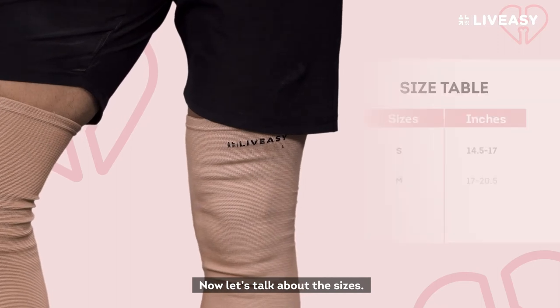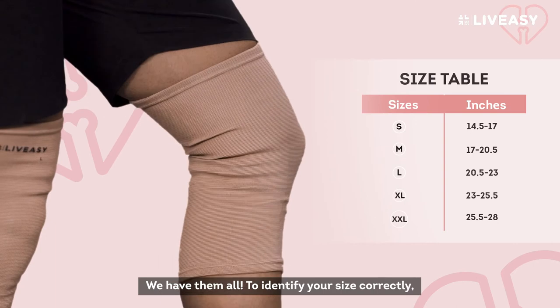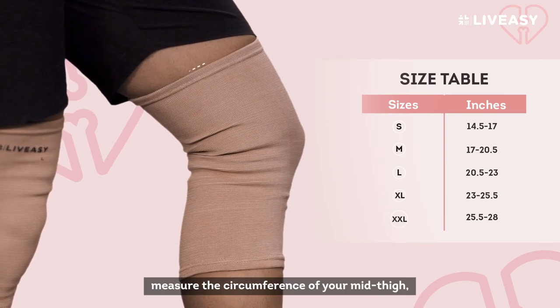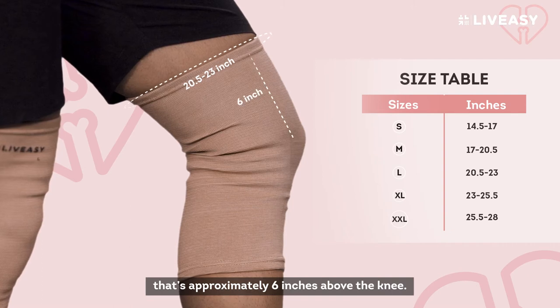Now let's talk about the sizes. As displayed on your screen, we have them all. To identify your size correctly, measure the circumference of your mid-thigh — that's approximately 6 inches above the knee.